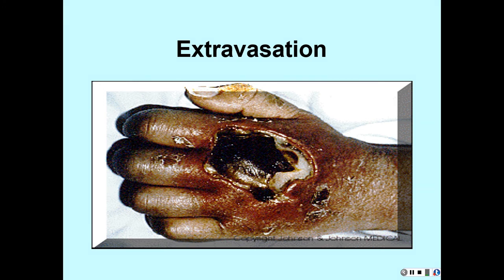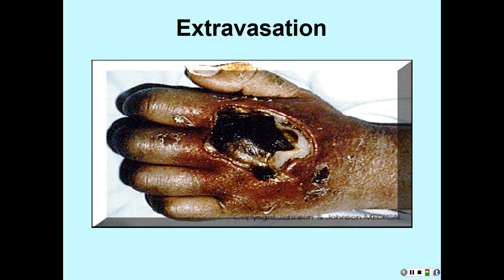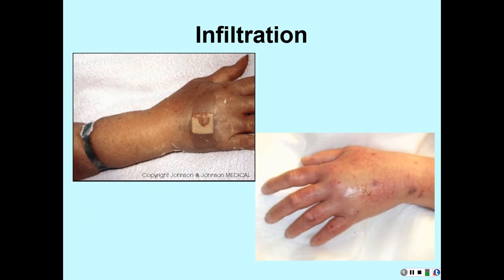Watch it. Okay? The most common thing that you're going to see with IVs is infiltration. This is just where you've got an infusion into the tissues, but it's not a caustic material. Right. The cannula, for some reason, becomes dislodged, and the fluids are infused into the surrounding tissues, or either the vein has been perforated.